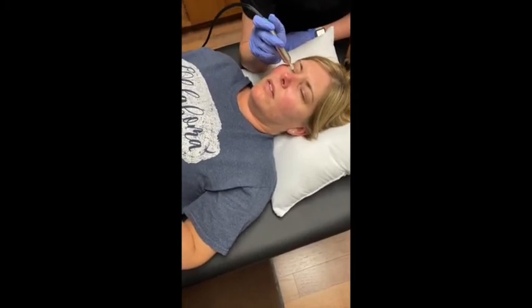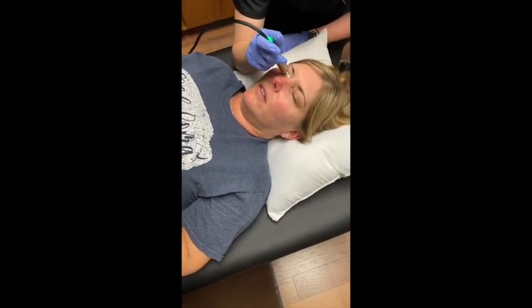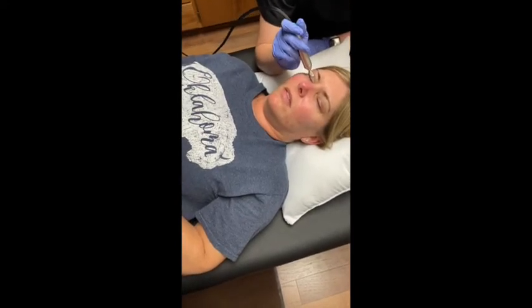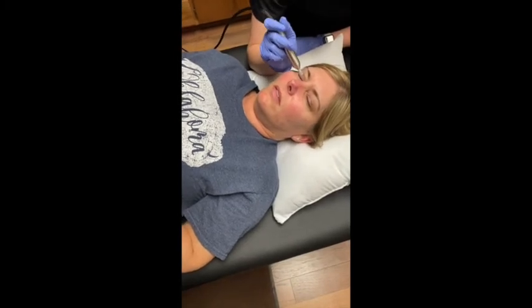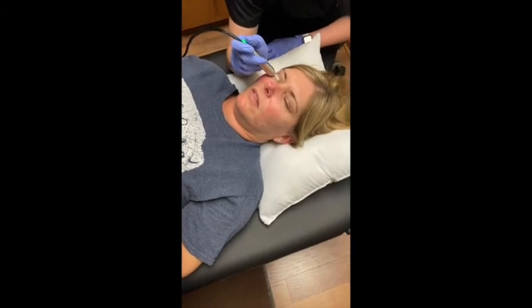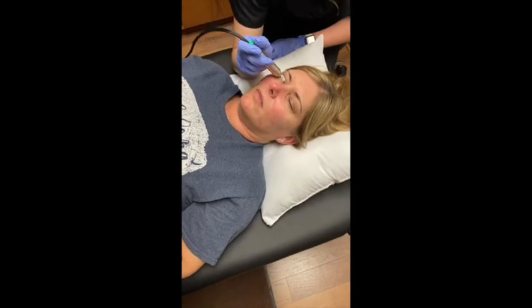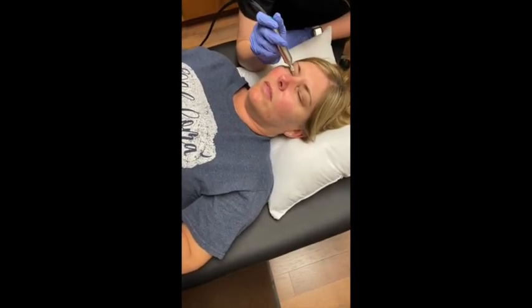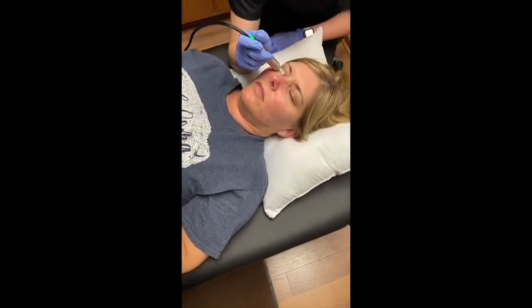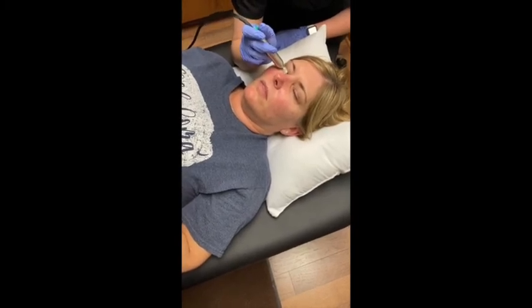And current research says that if we have glands plugged up and clogged up for long enough, they'll die off and we won't ever get them back. And so what ends up happening is we end up with a situation where someone that's been dealing with mild dry eye in their 30s and 40s and 50s becomes major dry eye in their 60s and 70s, and we can't do really anything about it because current theory says once dead, always dead. And so things like this flush those glands out, keep them alive, keep them acting a little bit more, and help keep things happy and moving so that when we are in our 60s and 70s, we don't end up with any problems.